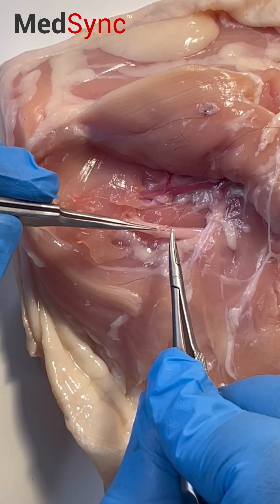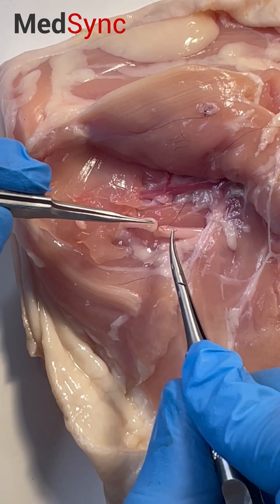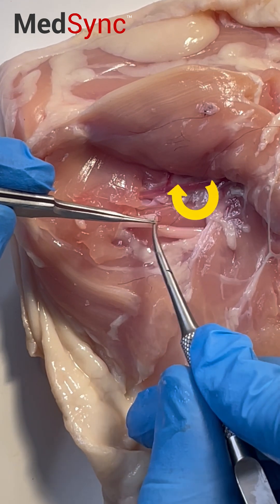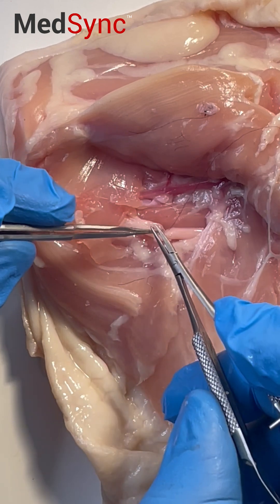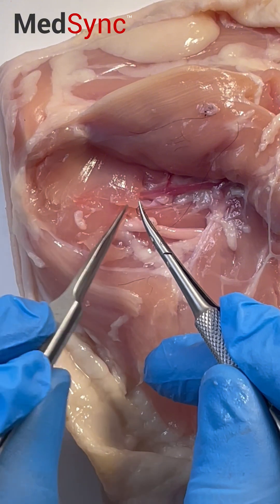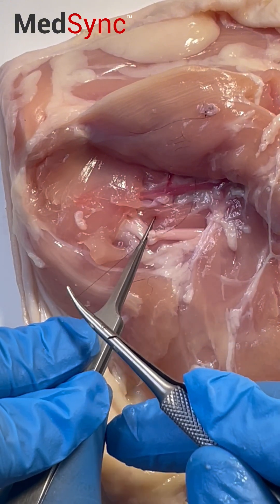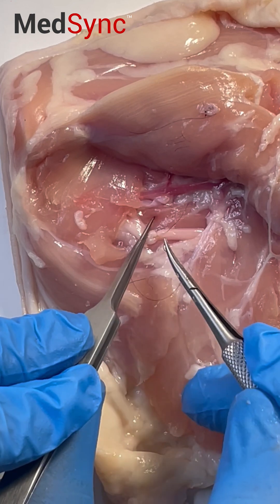Same principles apply: traction, enter and rotate. Pull the suture in line with the nerve, apply some counter traction, and create a short end and a long end.